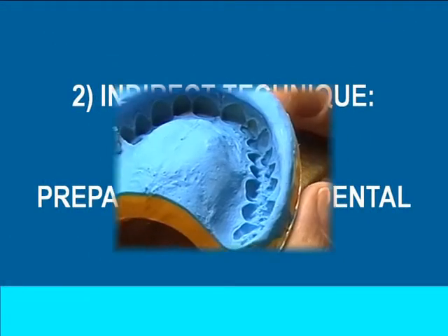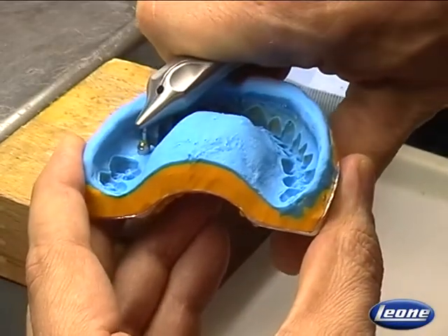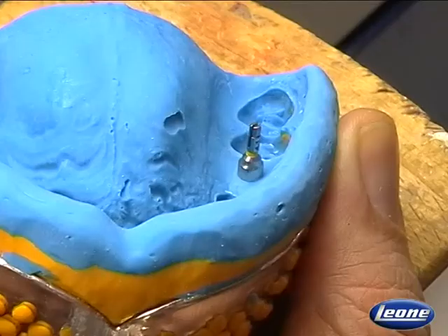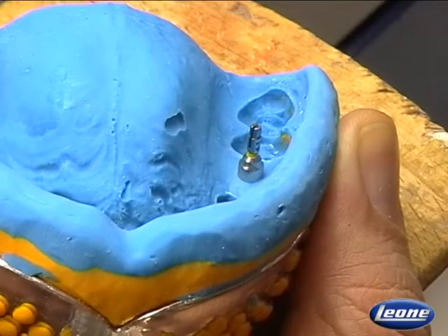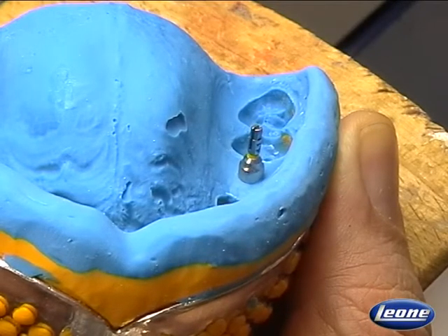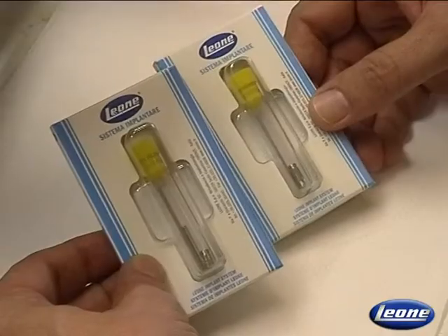The first thing to do is to control the correct position of the transfer, and if necessary to reposition it correctly back into the impression. In this case, a standard transfer has been used. It has a yellow color code which indicates the 4.1 implant abutment connection size. The transfer has also a laser marking.